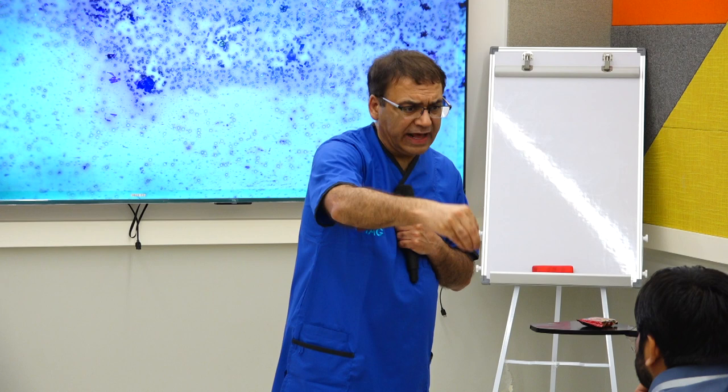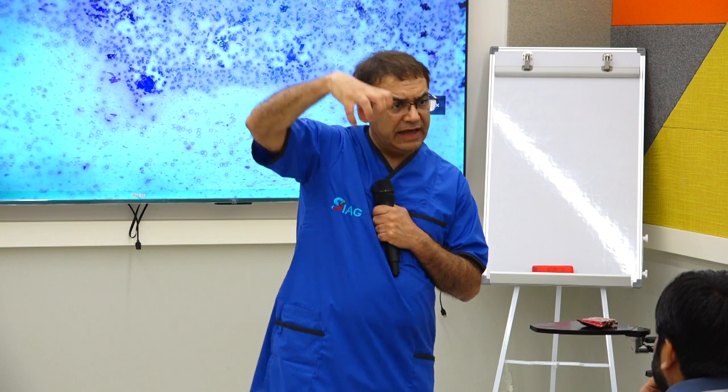So with the FNB needle, either once go into one area or maximum twice. Then bring it out. What you are asking is when you bring it out, do you get out of the tissue? No. You just come to the edge of it and then change the direction. There are different ways, what we call a fanning technique. You can move the big wheel away from you or towards you. That's what I would do first. If that doesn't work, gently move the scope in or scope out, or rotate the scope to the right or the left. So the whole goal is to go into a different area than the previous one. So there are different ways to do that.